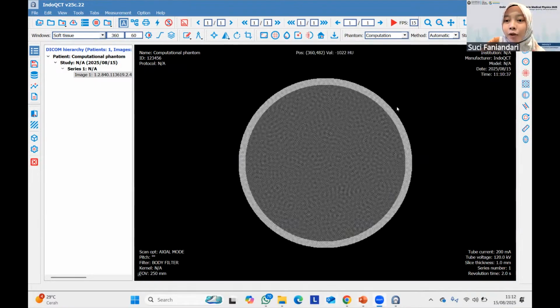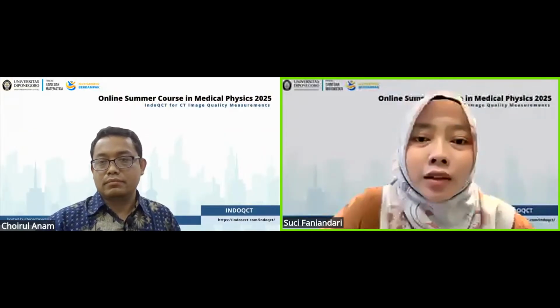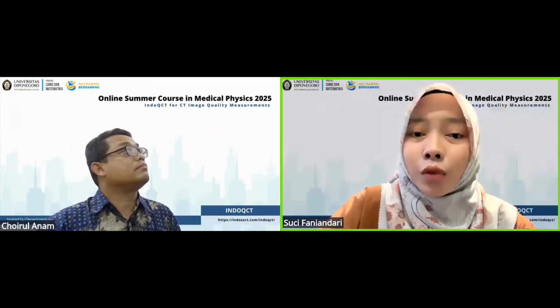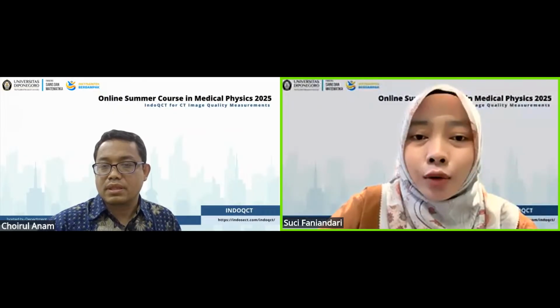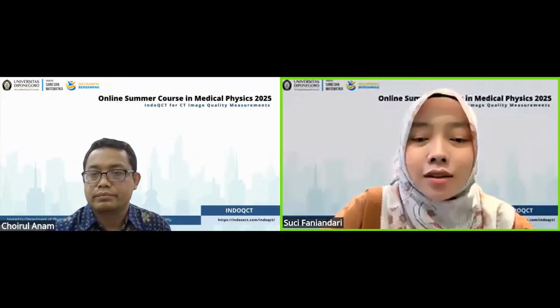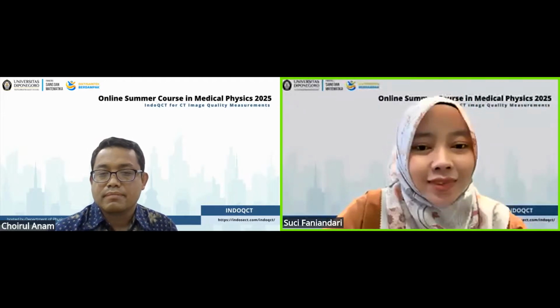We can start from the first question, Dr. Anam. Here is the question from Mr. Ahmad Zaki. When are parameters such as noise homogeneity and NPS clinically required, for example during the acceptance and QC processes? As far as I know, determining the noise uniformity value is how we evaluate the equipment's reliability based on the regulations, or uji kesesuaian, and the measurement guidelines provided by some manufacturers.